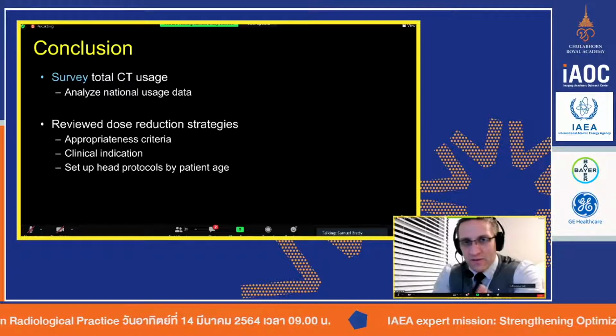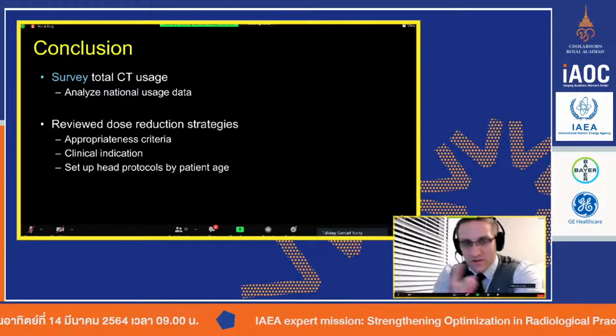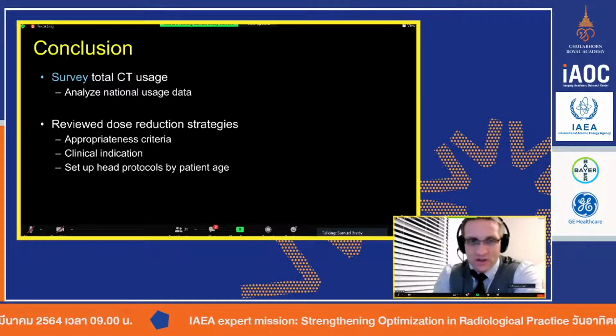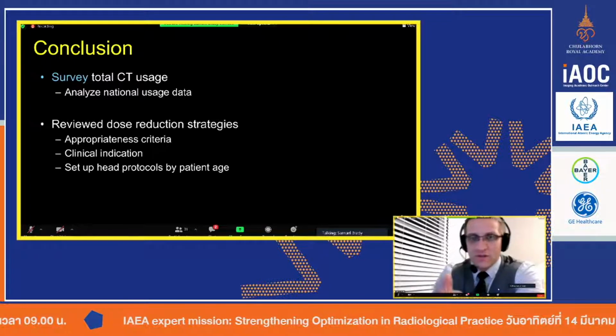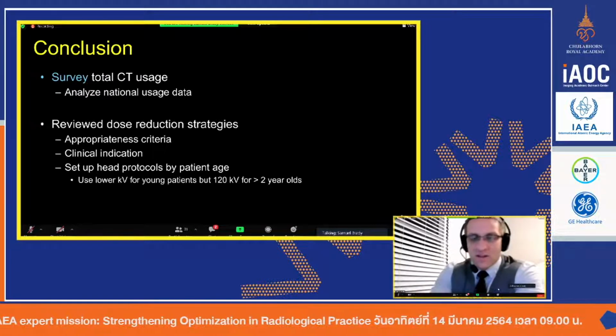And then if you're imaging in the pediatric world, for the little kids, for 0 to 6 months, 6 months to 2 years, you definitely need one or two, maybe three protocols at the very early years of the patient's life.